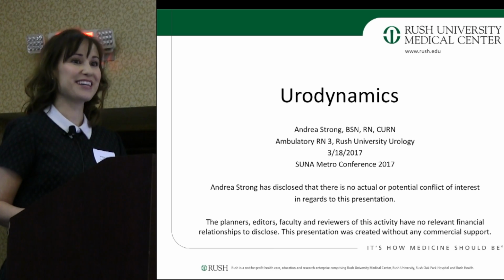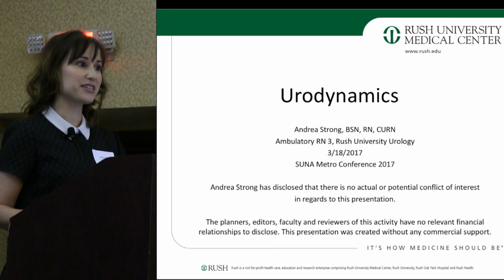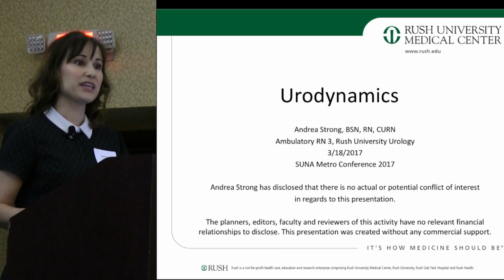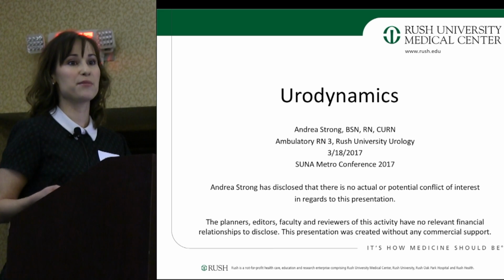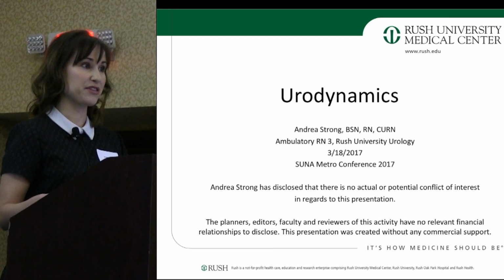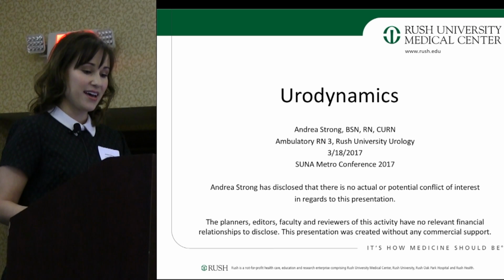I really love urodynamic studies. It gives you an hour, sometimes an hour and a half of uninterrupted time with your patient. You really get to learn more about them, more about their symptoms, and engage in a lot of therapeutic communication.